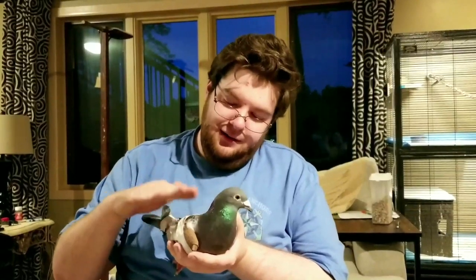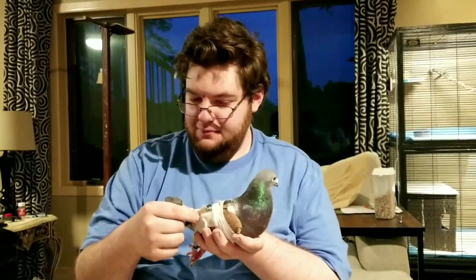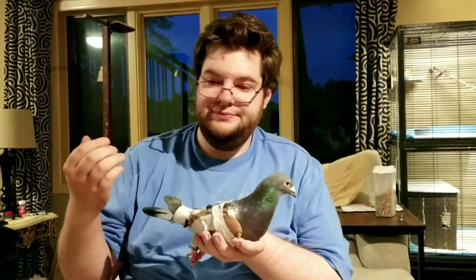So there's that. It's just loose down here — I can slide my finger underneath it so he can breathe fine. The sticky will actually get a little less sticky because they have dust in their feathers, which will stick to it and kind of make it less sticky. But this will hold in place probably for at least a day. You may have to repeat it a couple of times throughout the course of the wing healing. This little guy was actually able to slip out of this cast even with his wing being broken at the time, so you may have to redo it — because it just is how it is.